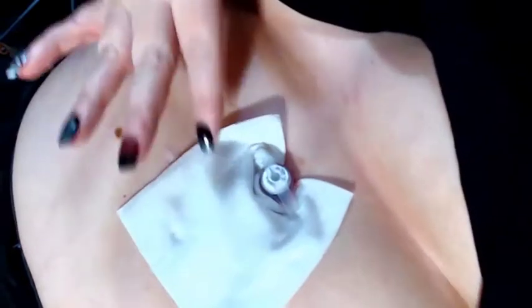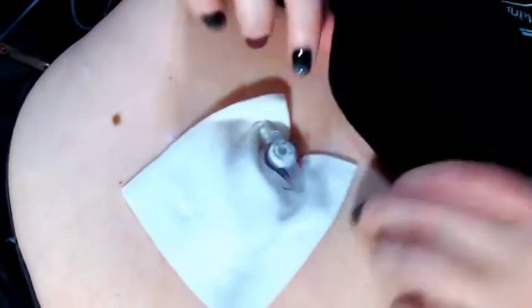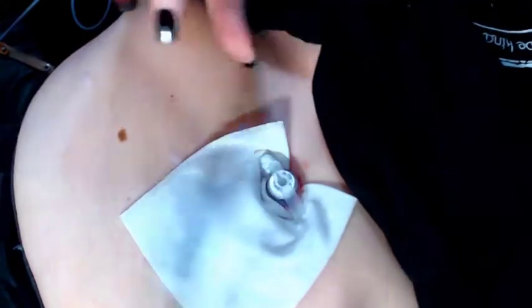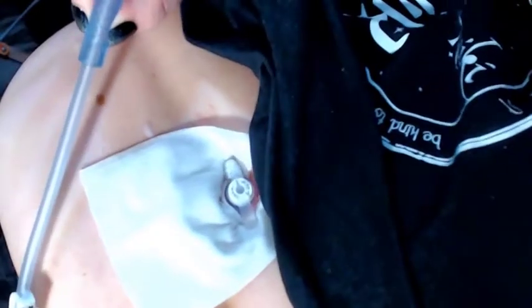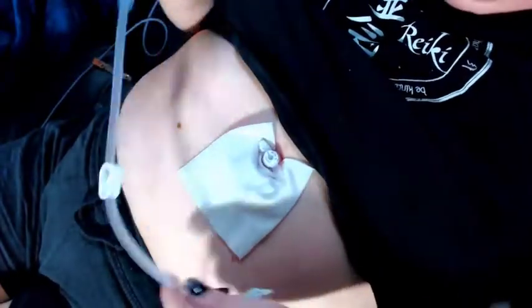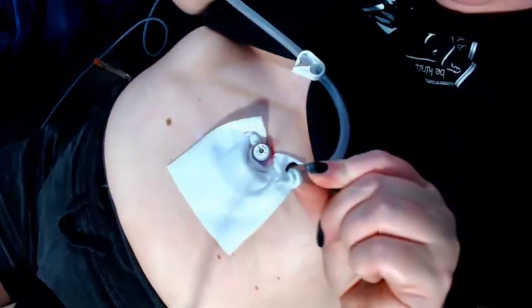Alright, right now I'm just tucking some of the gauze that they gave me around it because I don't have one of the kinds that I normally have on hand. But that's all there is to changing it out. Now, when I feed myself, I hook this up to it. Let me zoom back out again. So yeah, when I feed myself, I hook this up to it by just pulling this part up, and then I stick this part in there. And then of course the tube goes there, so that's how I feed myself.